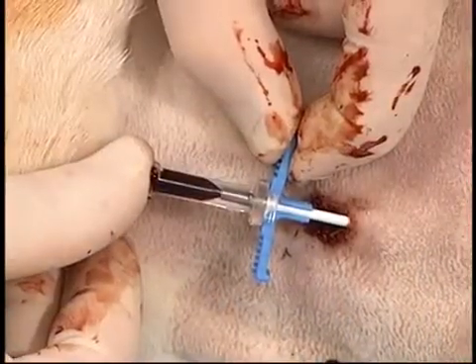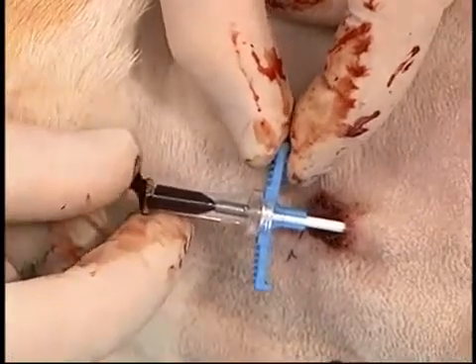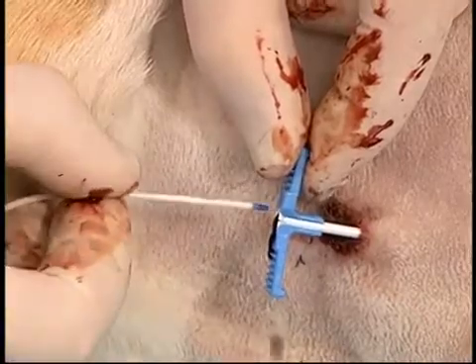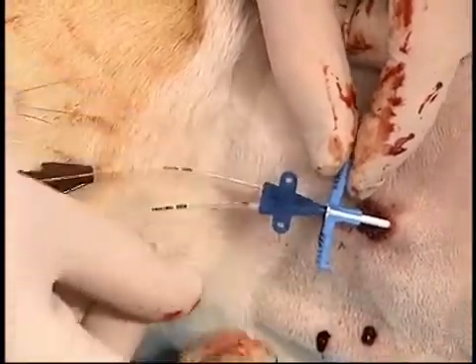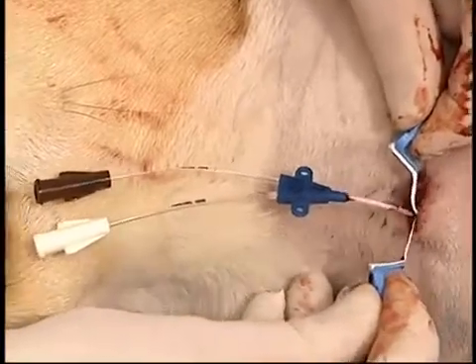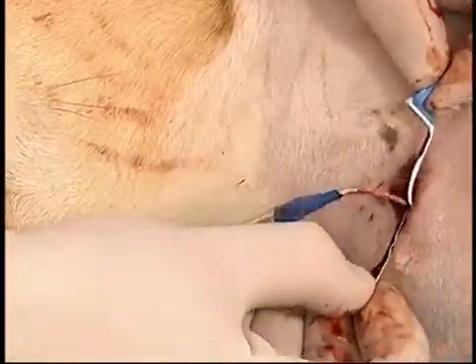The peel-away sheath with its stylet are inserted through the skin and then into the vessel. The stylet is then removed and the catheter is inserted through the center of the peel-away sheath. The catheter is inserted to the pre-measured location. Once at that level, the peel-away sheath is snapped off the catheter and gently peeled away while the catheter is simultaneously inserted further into the vessel.